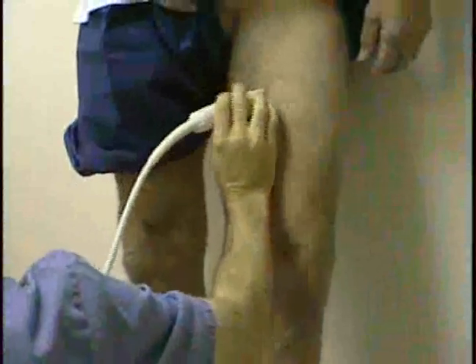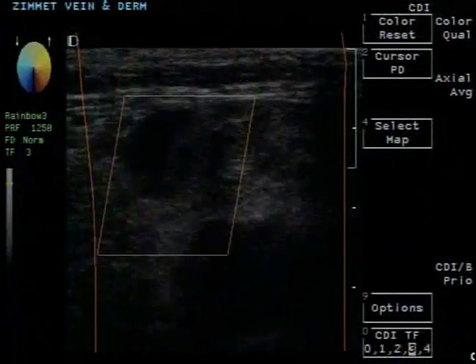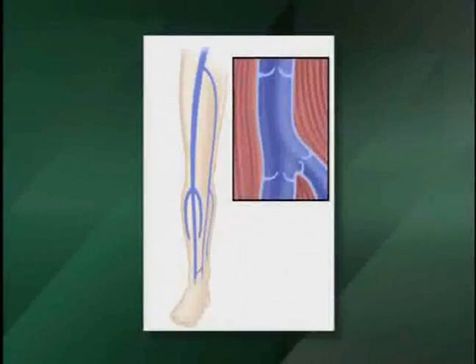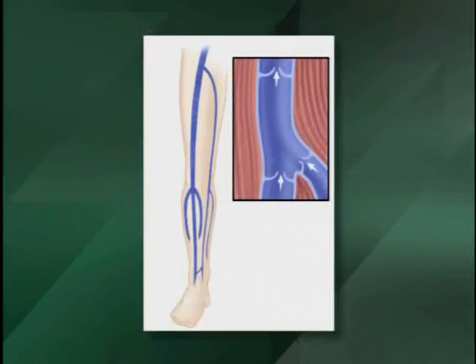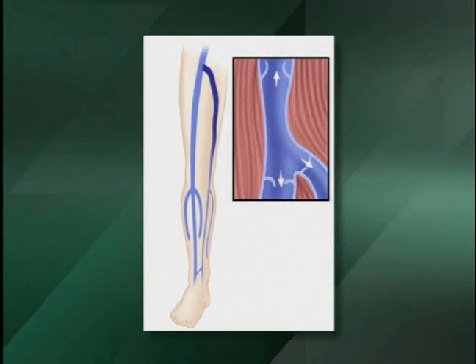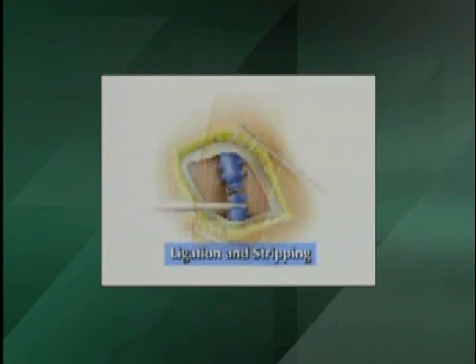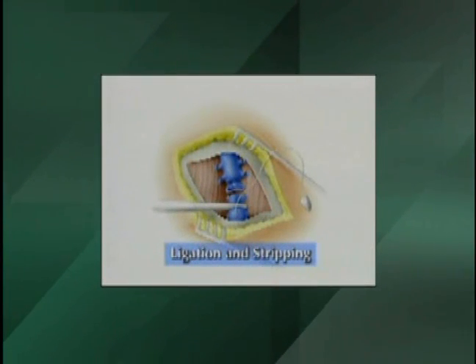Duplex ultrasound evaluation is essential in determining the underlying source of reflux in a patient with varicose veins. Saphenofemoral junction incompetence with greater saphenous vein reflux is the most common underlying cause of significant varicose veins. The traditional approach to treating SFJ incompetence with GSV reflux has been surgical ligation and stripping.